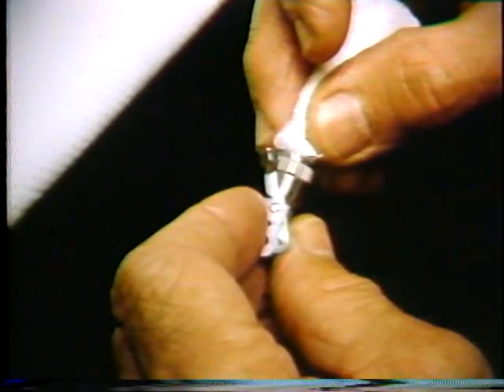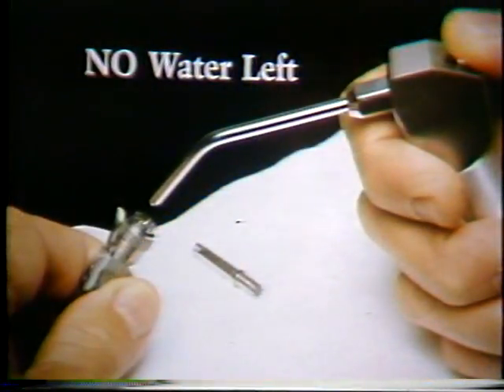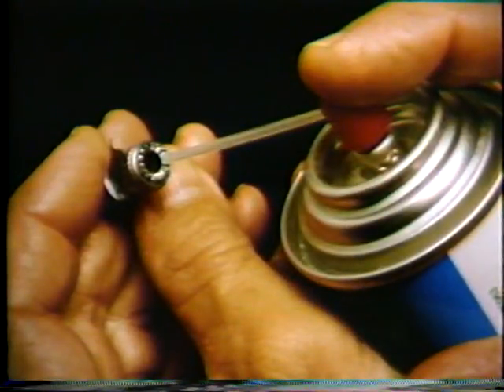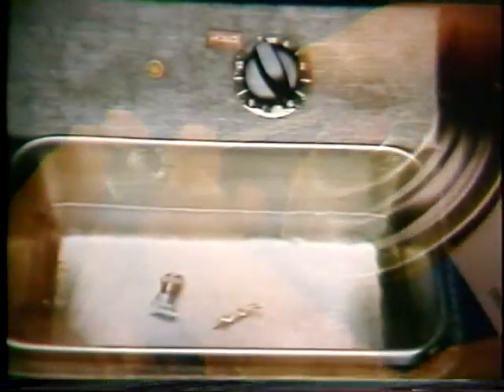It's important to get alcohol down inside the contra-angle, and it's equally important to dry it carefully and then blow it out with the air syringe so no water is left inside. After cleaning, use spray-a-day on both ends of the drive shaft, and also spray it into the hole on the shaft and into the back end of the contra-angle.